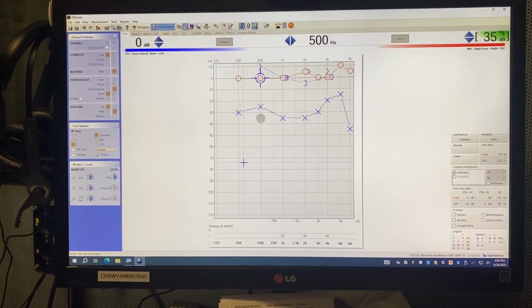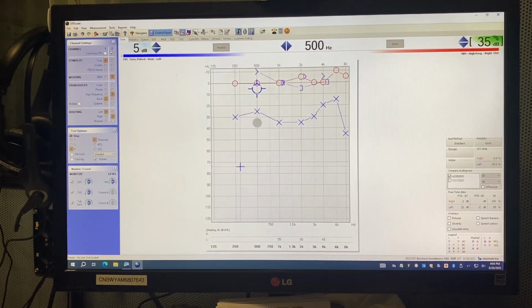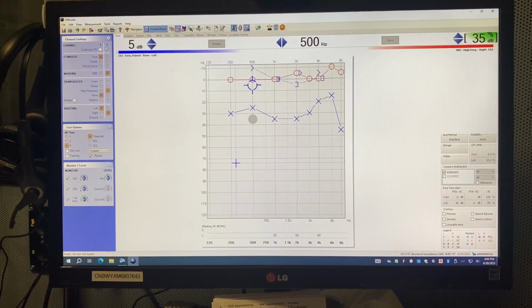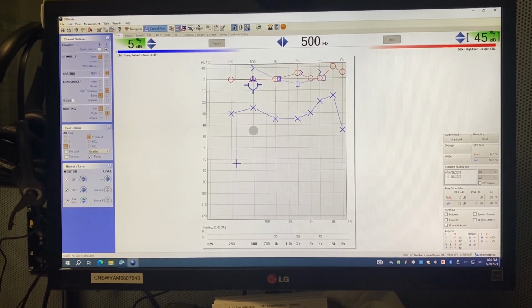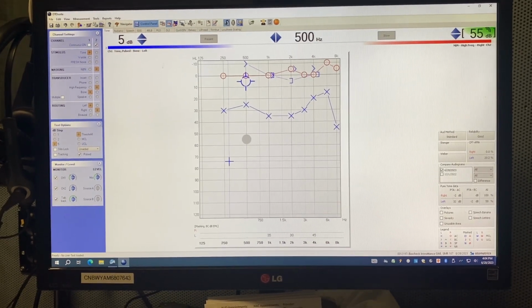No response, up 5. We got a response. Let's start our plateau again. We're going to go up 10. Got a response, up 10.